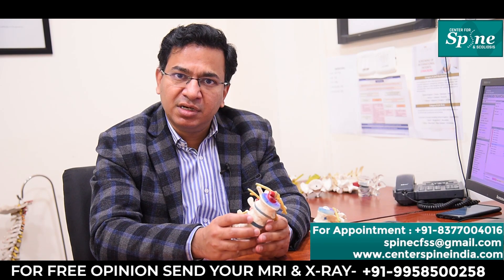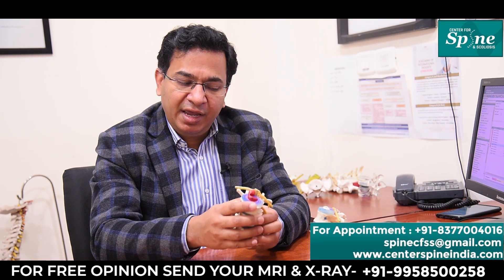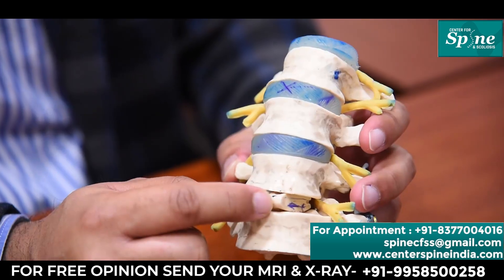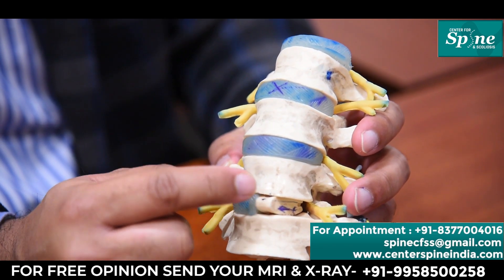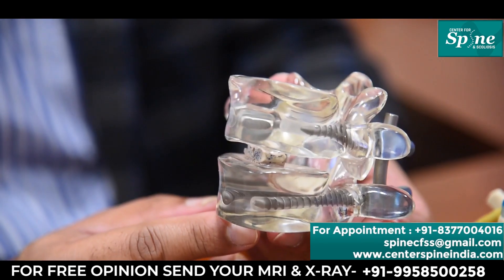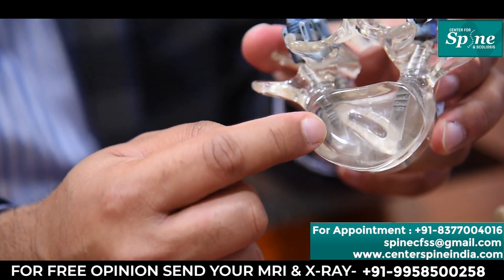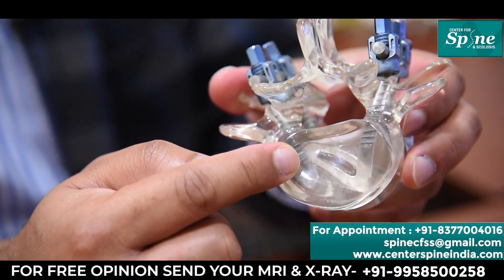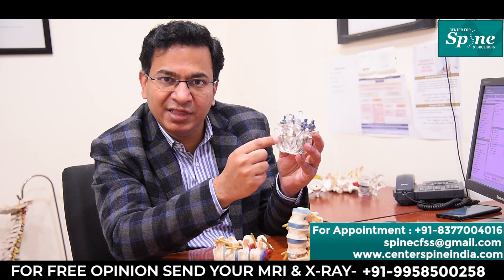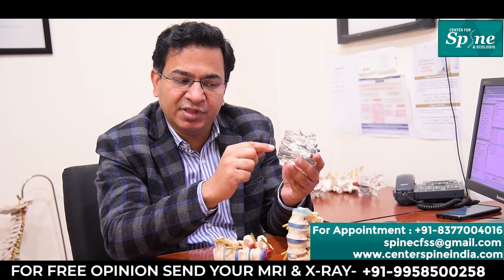In this surgery we remove the disc between these two bones, and in place of it we put an interbody cage which is made up of either PEEK or titanium material. This cage is empty from inside, as you can see in this transparent model. We fill this cage with bone graft and place it in between the two bones.